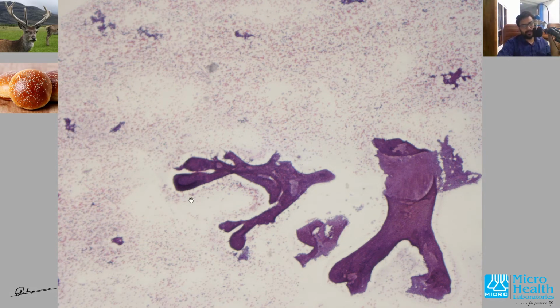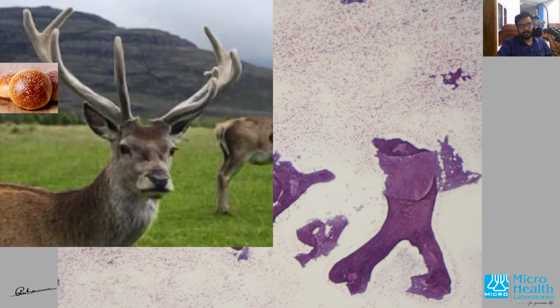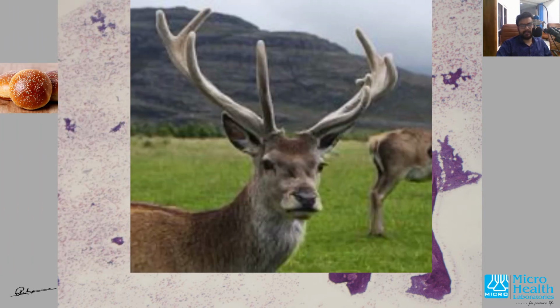All right, if you look here, it's an antler appearance. This is antler. Antlers are structures that you see on the deer family, and it is not antler horn, because antlers and horns are different. Antler is actually an extension from the skull bones, and they shed it every year, deer and whatnot, and it is usually seen in male deer, except in reindeer, where it is seen in both sexes. So this kind of appearance is called antler.